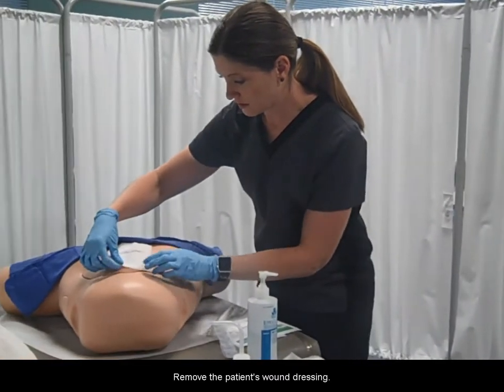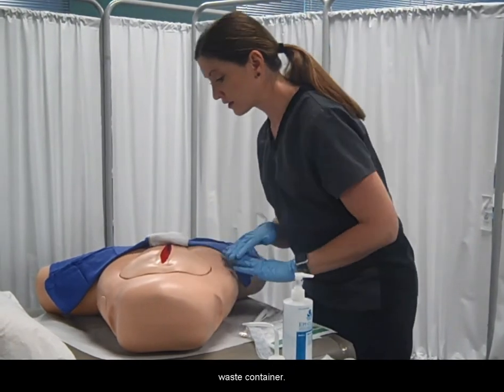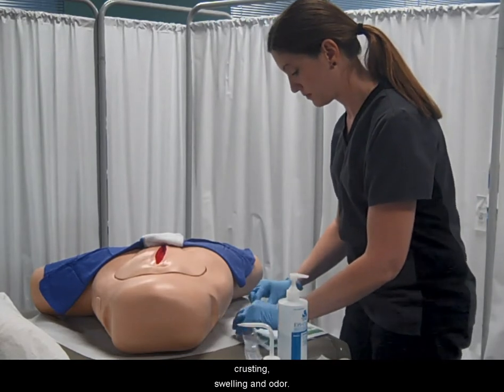Remove the patient's wound dressing and dispose of used dressing materials in a biohazard waste container. Observe the wound for redness, crusting, swelling, and odor.